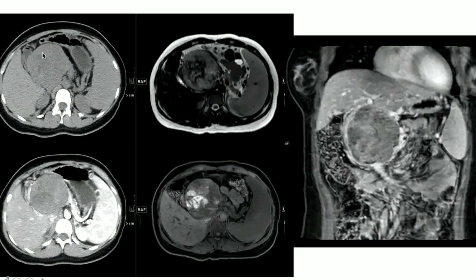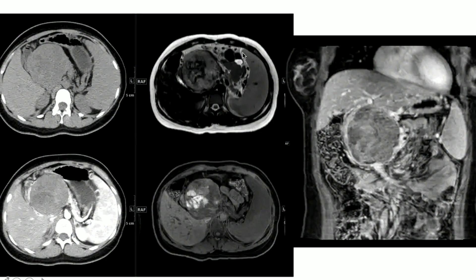On CT, the mass is heterogeneous, slightly hyperdense, with no convincing enhancement — possibly a small area of enhancement. On MRI, it is clearly very heterogeneous and hemorrhagic — bright on T1, dark on T2. An important note: you should always request a subtracted image to distinguish true enhancement from hemorrhagic signal. If solid enhancement underlies the hemorrhagic mass, subtraction imaging would reveal it clearly.